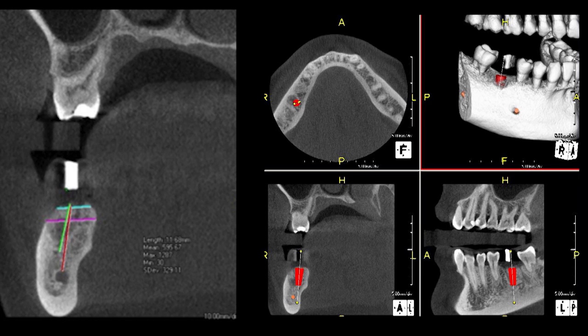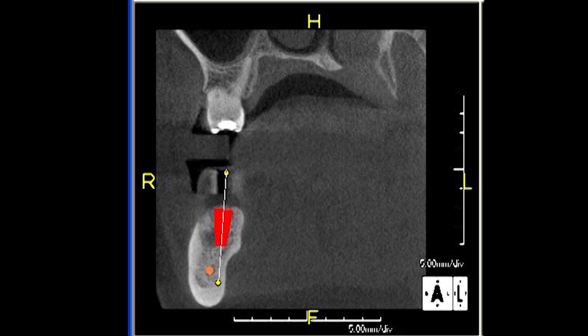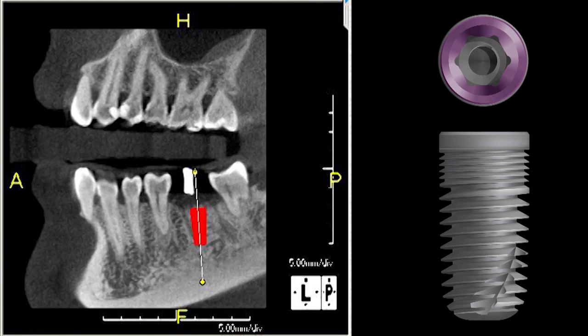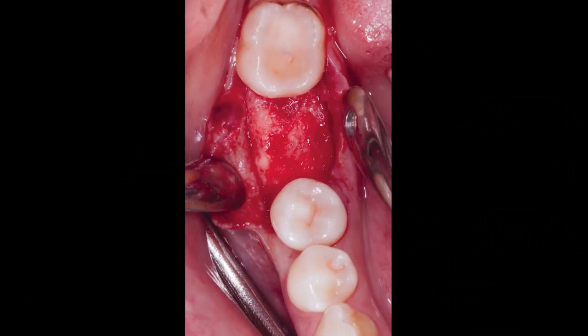Alveolar ridge measurements using Proxion 3D Viewer predicted optimal buccal-lingual, mesial-distal, and apical implant position, and also helped visualize vital anatomical structures and helped me decide if any bone grafting would be necessary at the time of implant placement. Based on this three-dimensional data, I was able to accurately measure the height and width of the bone and choose the exact size implant I wanted to use. I chose a 4.7mm by 10mm Inclusive Tapered Implant, and I felt comfortable with the 10mm length — not only to stay away from the IA nerve, but also from the submandibular depression. Following appropriate anesthesia, I made a crestal and sulcular incision and used a periosteal elevator to raise a full-thickness flap.